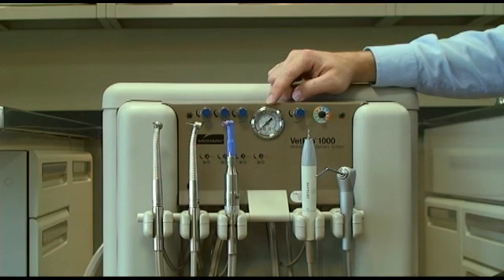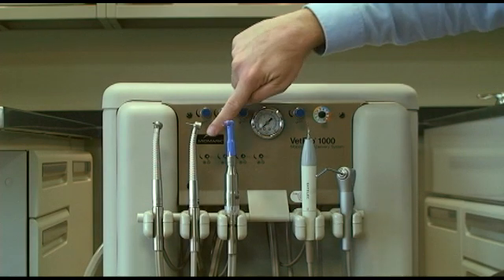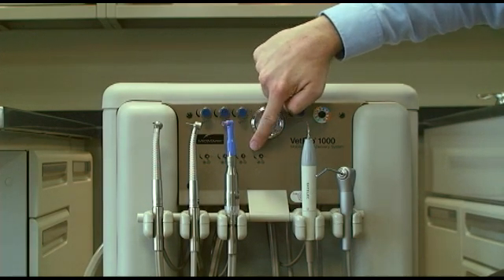Between the water valve knobs, you'll notice an air gauge that indicates handpiece pressure. You control the handpiece air supply pressure by using the drive air adjustment valves located below the blue water needle valves.